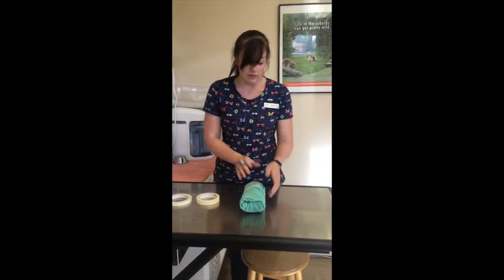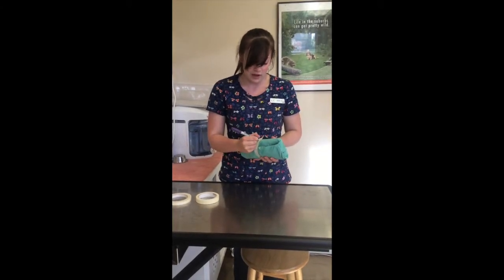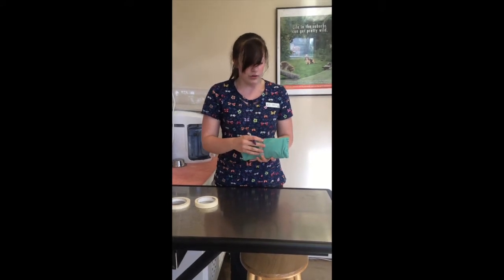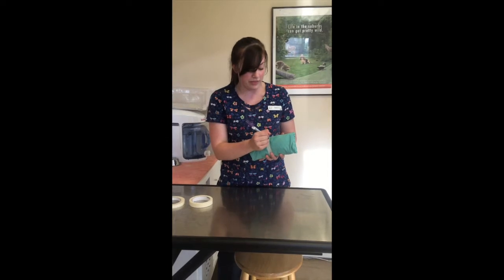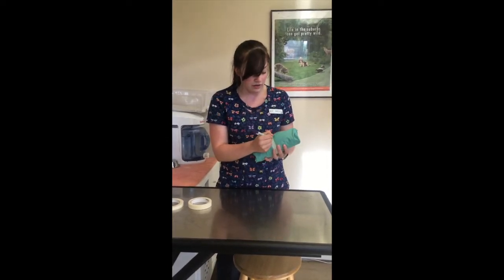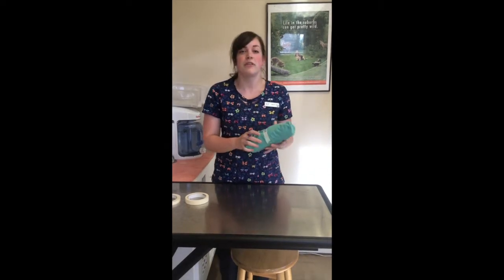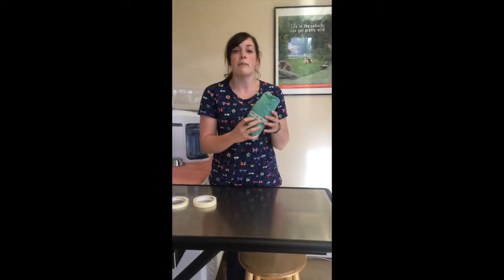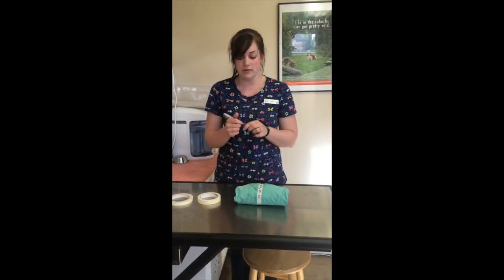So now that that's on, I'm going to go ahead and label it. You want to label your packs with the date that they were wrapped, so today's date. And then you want to label what the pack is. So this is a feline spay pack, so I'm going to make sure I put that on this label. And then you want to put the initials. This will let people know who wrapped the pack if there's a problem with it, so they can come to me with any concerns. And that is how you wrap a surgical wrap.